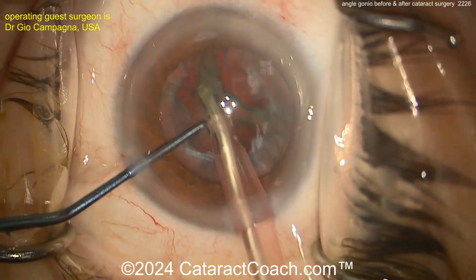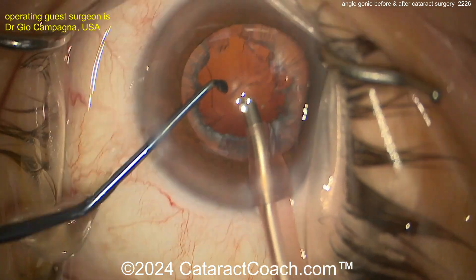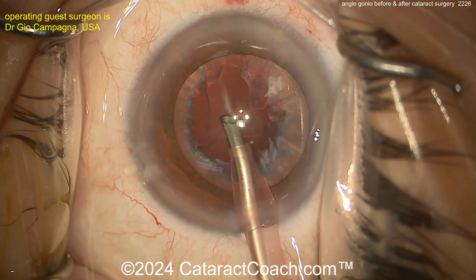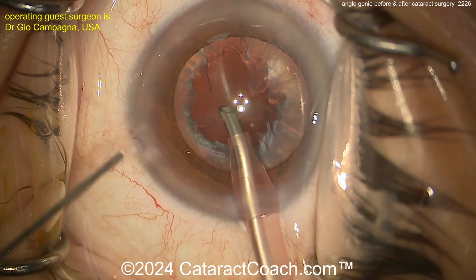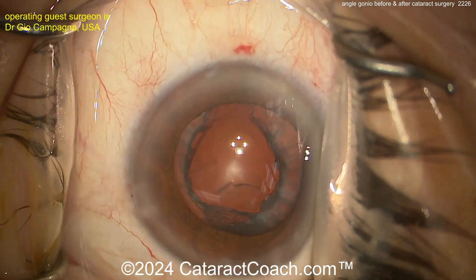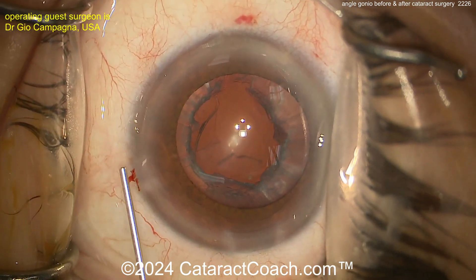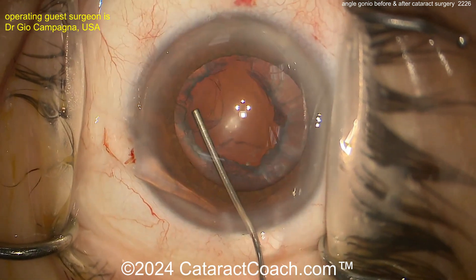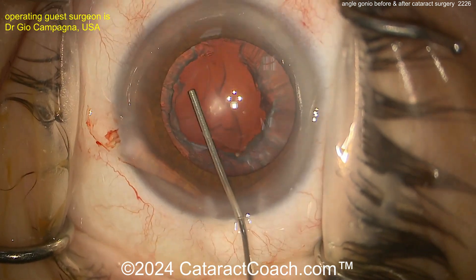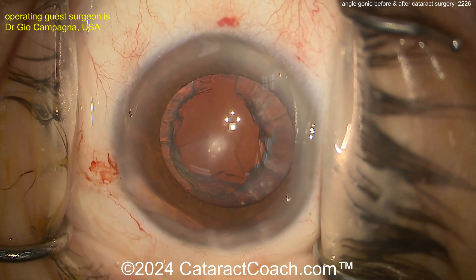If you have a patient who's a cataractous age with some early cataracts and very narrow angles, this is the ultimate solution. Think about it — taking out this four-and-a-half-millimeter-thick human crystalline lens, the cataract, and replacing it with a man-made IOL that's a millimeter thin, maybe even thinner. That really restores the angle anatomy. So a little more viscoelastic going inside the eye here, and some cortex removal.